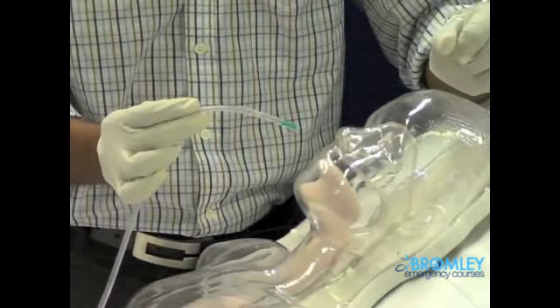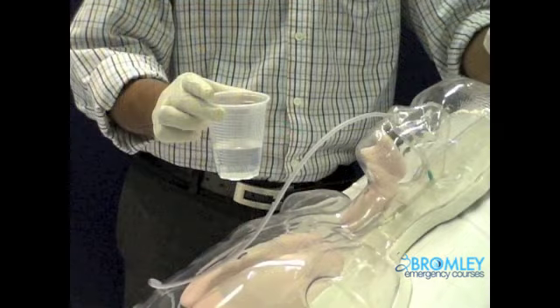This procedure video will take you through the techniques of placing a nasogastric tube. Though this may seem a relatively straightforward procedure, in an OSCE examination it is important to stick to a generic template when approaching this station. This should include a formal introduction, a good and clear explanation of the procedure, and the obtaining of verbal consent.